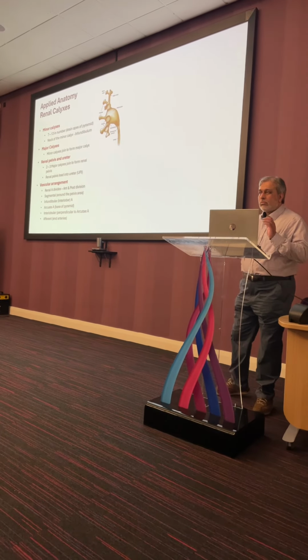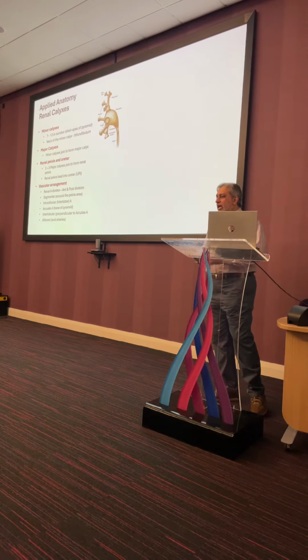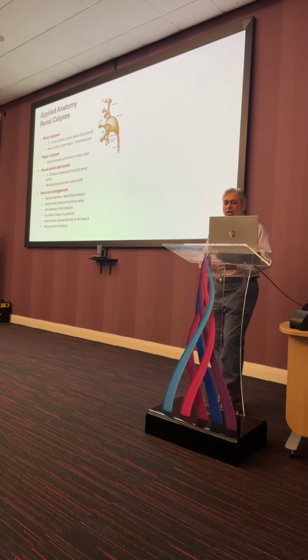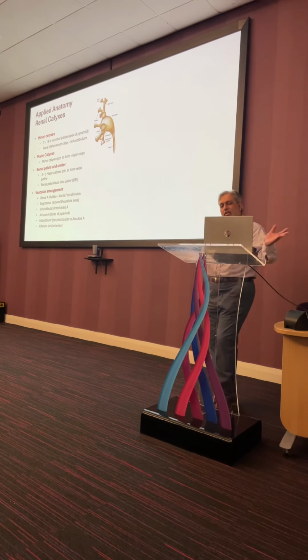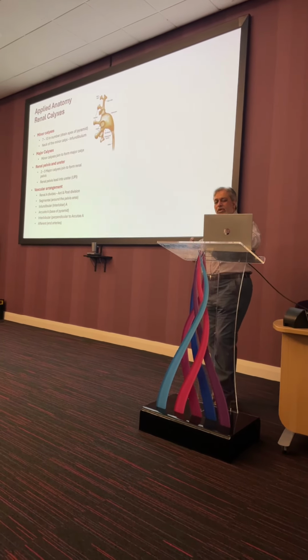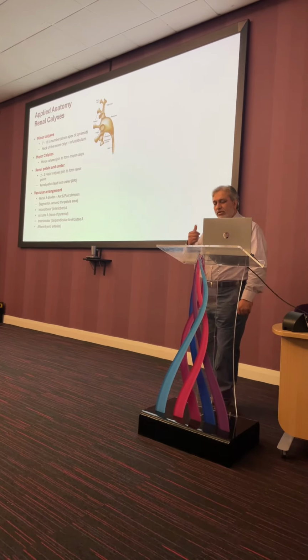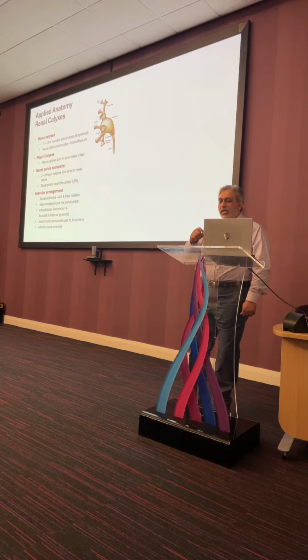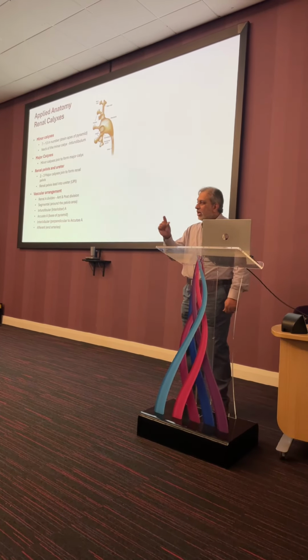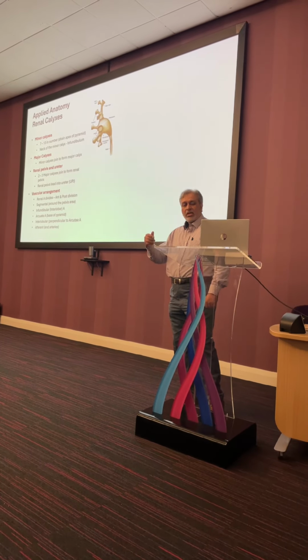So now we are going into the kidney, to what exactly we'll be finding as an endoscopist, what you should be knowing, because that was from the outside. In the kidney, you see the calyxes, which are formed in various arrangements: upper, middle, lower, and then some minor calyxes. We'll see how these are formed. And then they go into the funnel tube like a pelvis, which has its own diameters, we will discuss, and then into the tube.